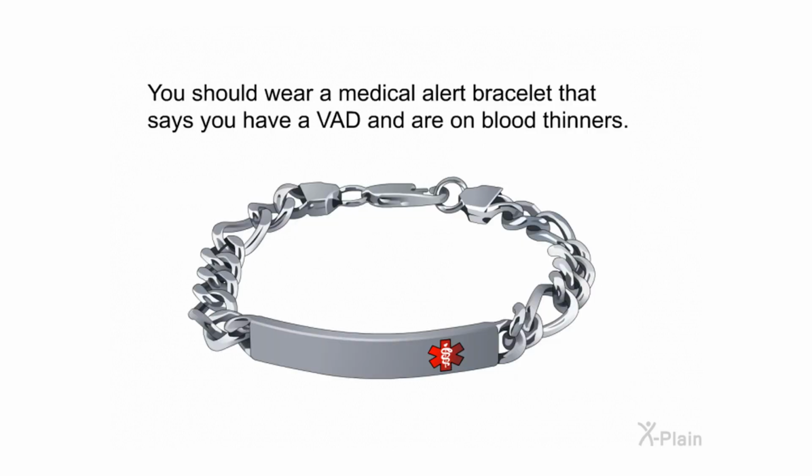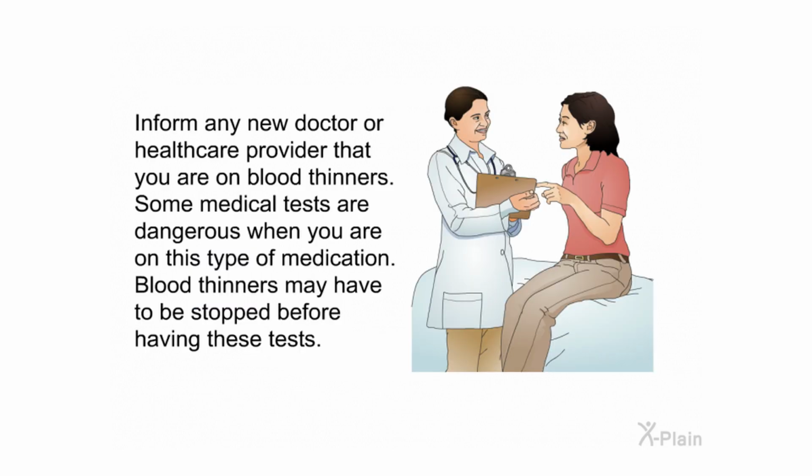You should wear a medical alert bracelet that says you have a VAD and are on blood thinners. Inform any new doctor or healthcare provider that you are on blood thinners. Some medical tests are dangerous when you are on this type of medication. Blood thinners may have to be stopped before having these tests.